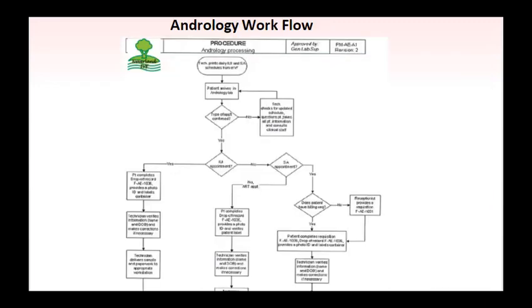Each department has its own workflow, and the chart above shows part of this flow for the Neverland Embryology Lab. The process of writing down the workflow is critical to understanding how a particular procedure involves staff, equipment, and other departments. Performing an analysis of the flow of work allows for identification of inefficiencies and areas where errors can occur.